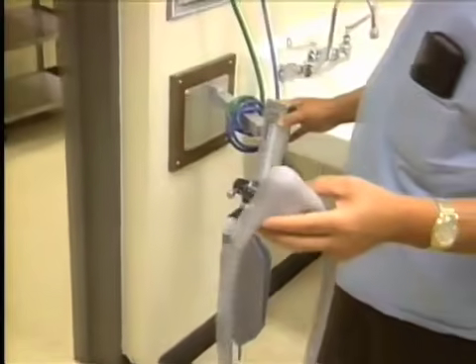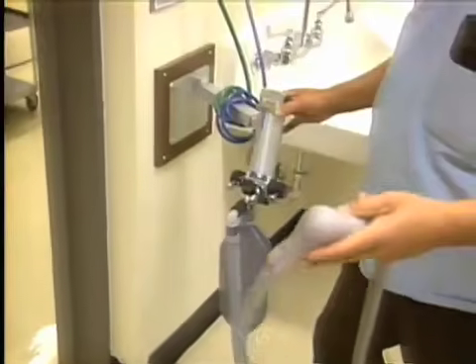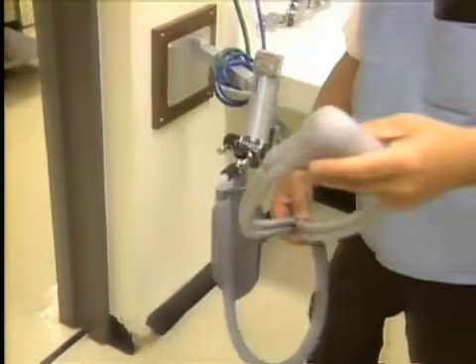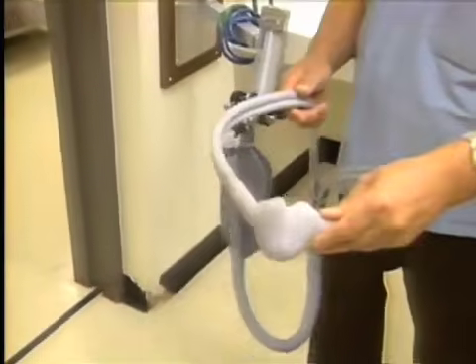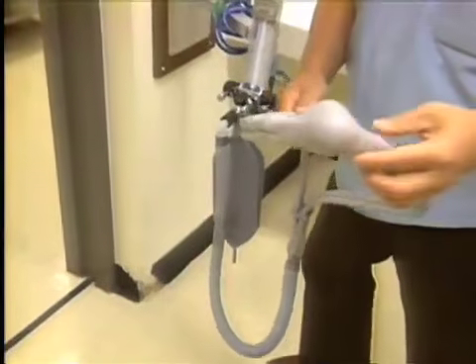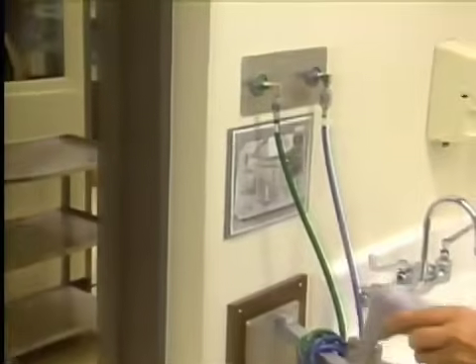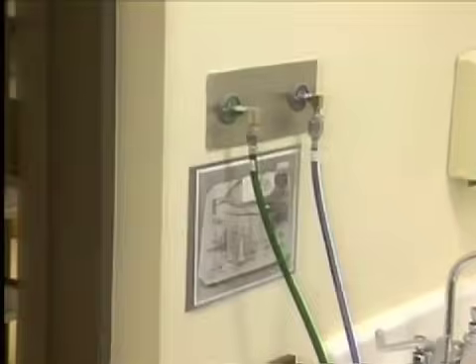This wall-mounted unit will consist of a nose piece, the tubing to deliver the gases, a rebreathing bag, as well as the monitors. This is a fail-safe system. Fail-safe in the sense that it will not operate without oxygen. The supply of oxygen and nitrous oxide for this machine is delivered from a central point.